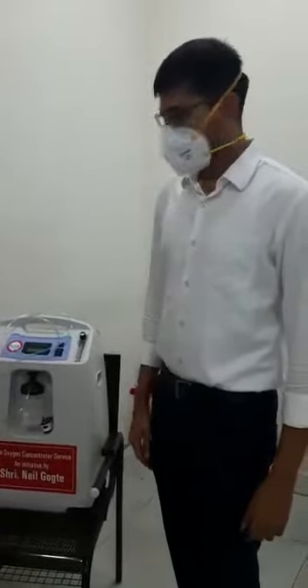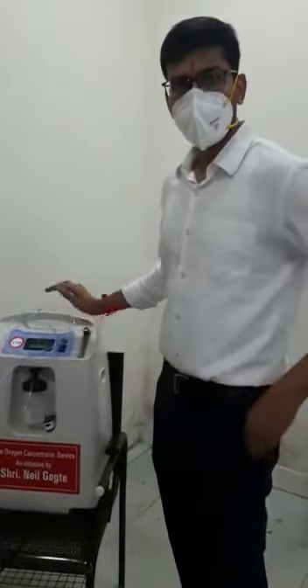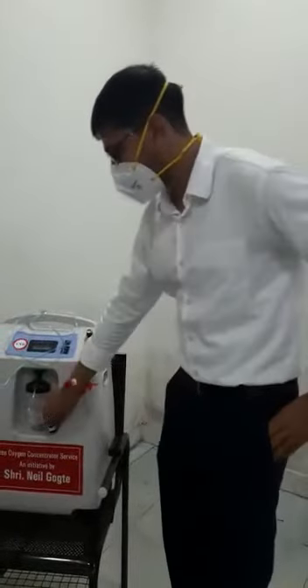Hello everyone, I am Dr. Bidek. Now I will demonstrate how to use an oxygen concentrator, when to use it, and to whom to use it.